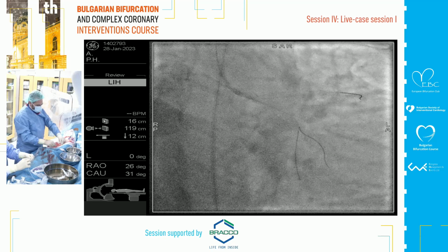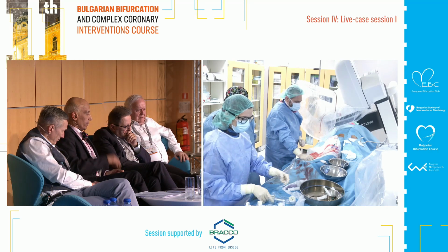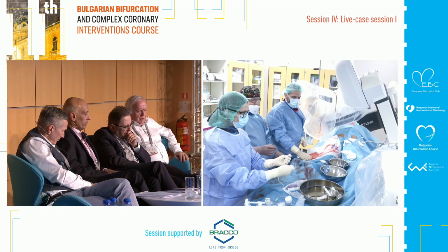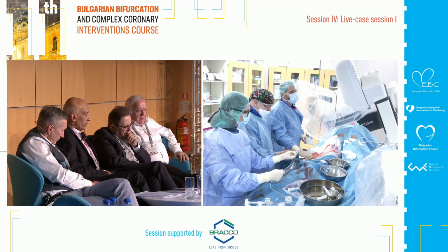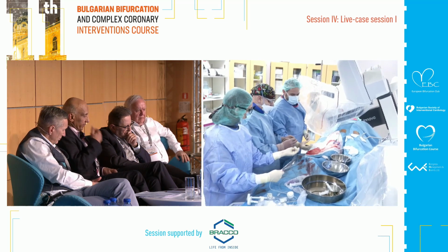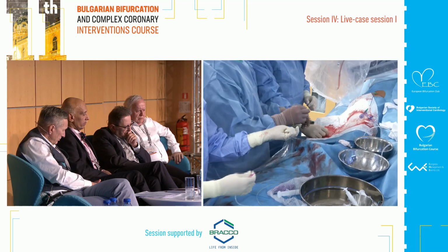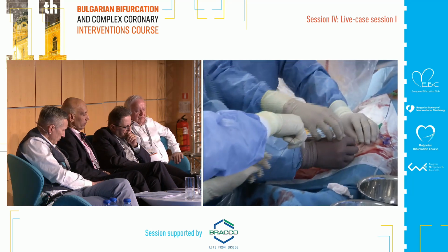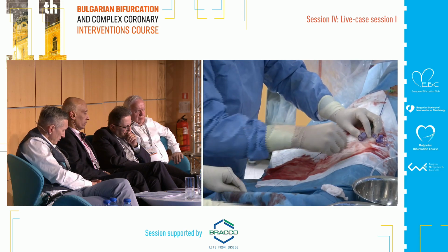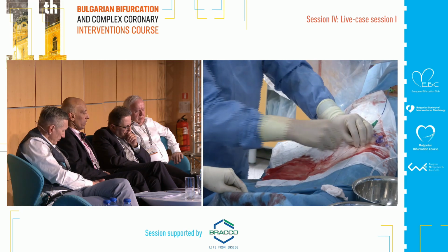Gianluca, have you performed a POT in this very short left main? Yeah, we did a POT with a 3.5 by 15 balloon. This is the last one. With the wire, do you think you were out of the stent or not? Of course, it was just proximal, just in front of the carina, and the rest of the balloon was outside in the aorta.